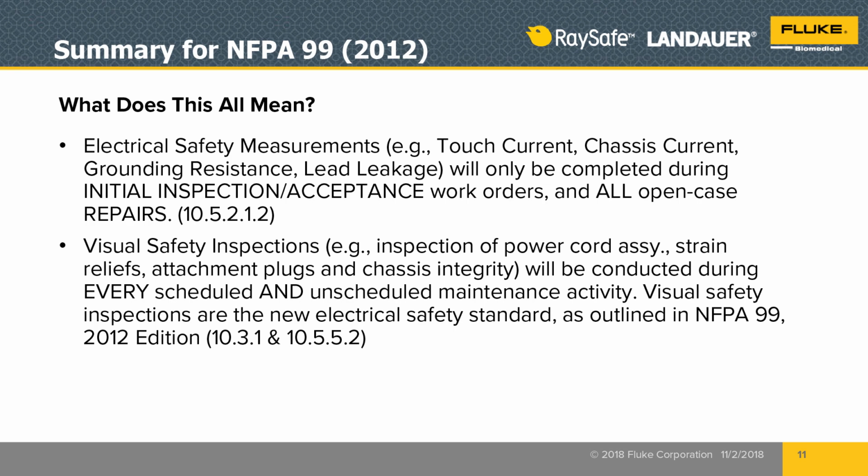It is worth noting that visual inspections are mandated annually. So that's looking at your power cord, strain relief, making sure the chassis isn't cracked and broken. All of those basic things that we're used to looking at, just visually, does it look like it's intact and going to be working correctly? And that is still mandated for every scheduled and unscheduled maintenance activity on a given piece of equipment.